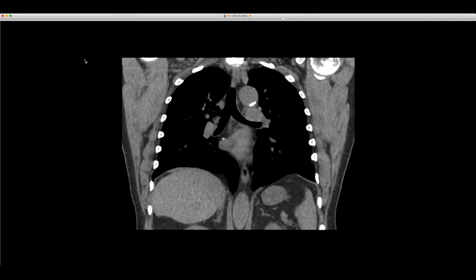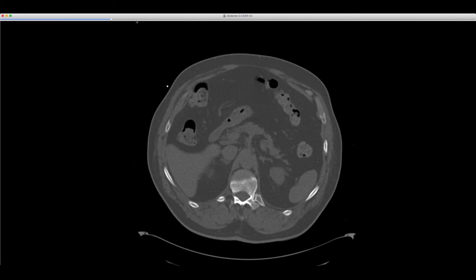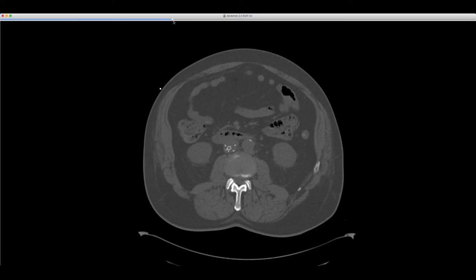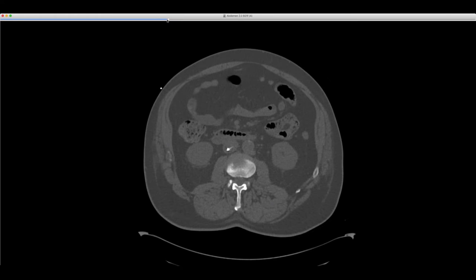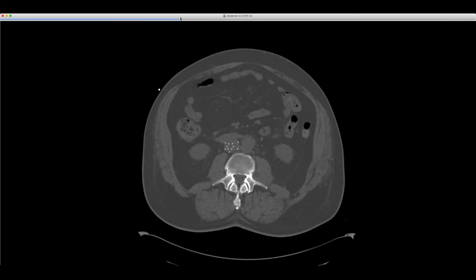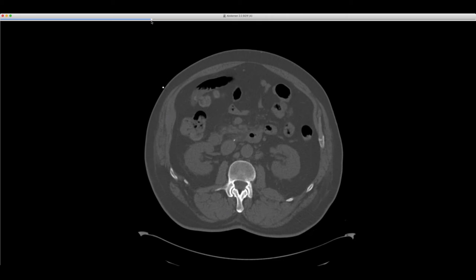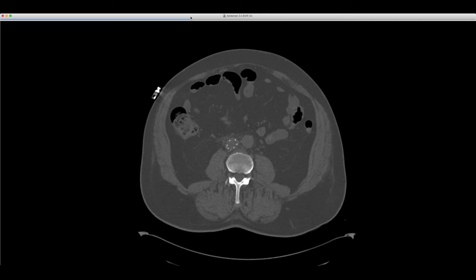The abdomen and pelvis CT is nice because those things should have 12 struts. They have 6 inner and 6 outer. And when you showed that one image, you could see that there's 6 inner and only 5 outer, right there, just a little lower. Yep. So you know that one of them is not where it should be, and that was the one that went up. So can we speculate that it impinges somewhere, and because you have a beating heart over a period of time, and it's such a sharp little thing, it just burrows its way through and ends up where it ends up? Yeah, just because the heart's beating and it just perforates somewhere randomly.